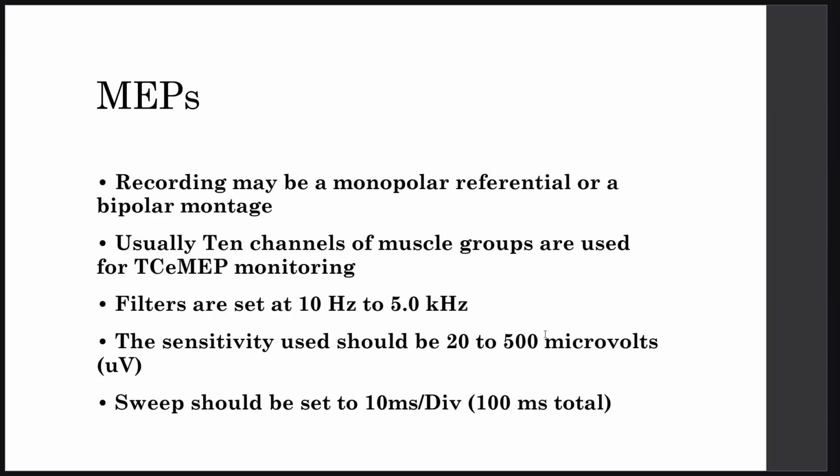The protocols to record from the muscles differ, as if you tailor the dress according to the patient. According to the site of the pathology and the type of the insult, you choose the muscle. In some pathologies, you need to choose the muscles according to root innervation. In some pathologies, you need to record the muscle according to nerve. Others, you need to record the muscle according to distal and proximal. It is like the EMG. You tailor the dress on your patient. You don't make them wear the same dress.